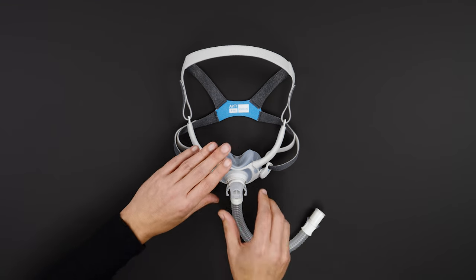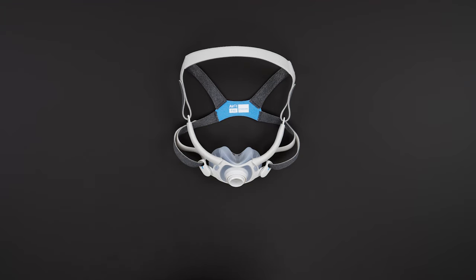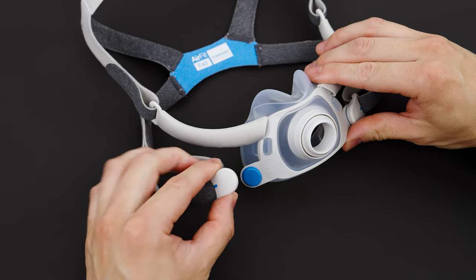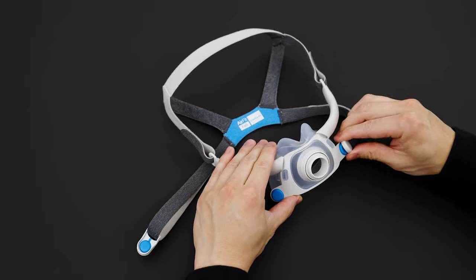Optionally, squeeze the side buttons on the elbow and pull from the mask. You can put this aside for now. Twist and pull both magnetic clips away from the frame magnets.